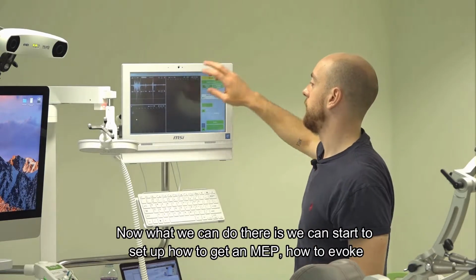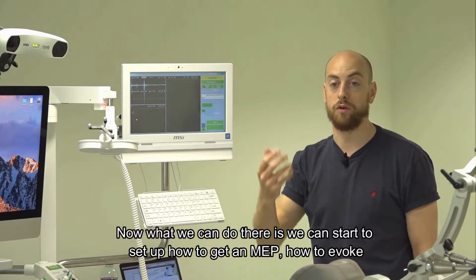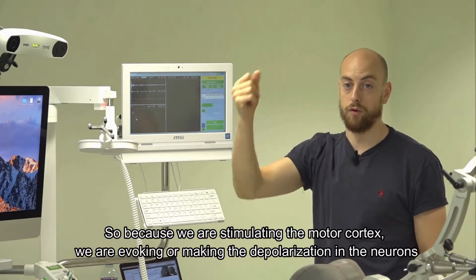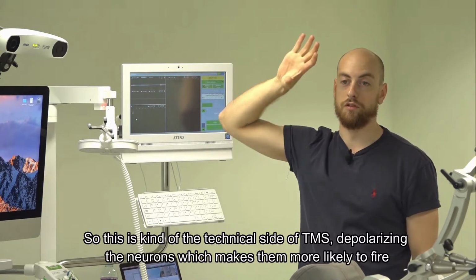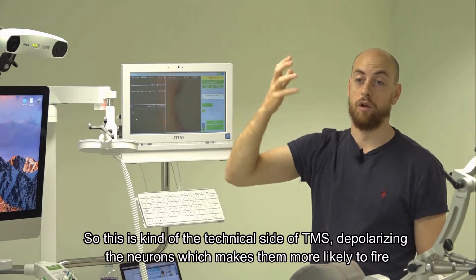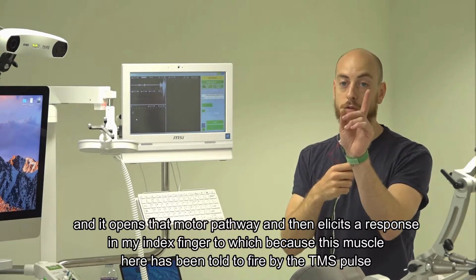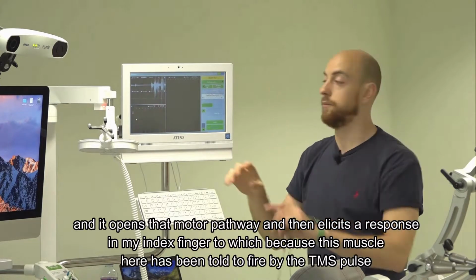Now what we can do is start to set up how to get an MEP, how to evoke. MEP is motor evoked potential. Because we are stimulating the motor cortex, we are evoking, we're depolarizing the neurons. This is the technical side of TMS. You're depolarizing the neurons, which makes them more likely to fire. So when you send them an electrical current, it opens that motor pathway and then elicits a response in my index finger, because this muscle here has been told to fire by the TMS pulse.